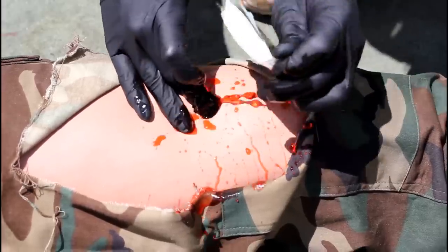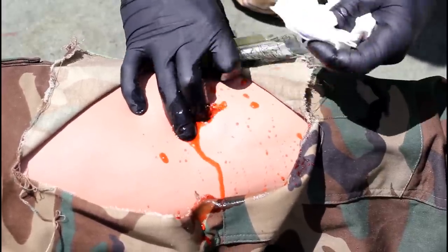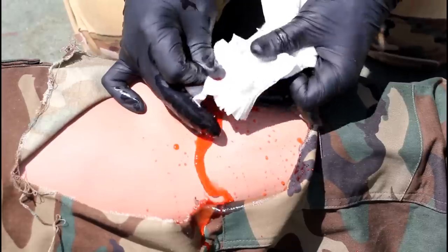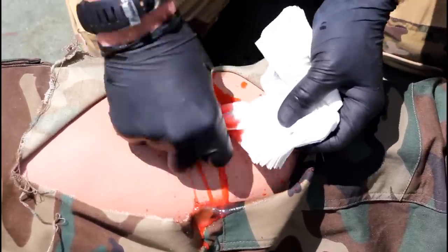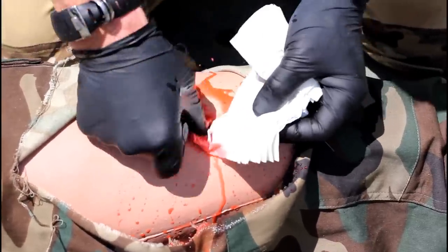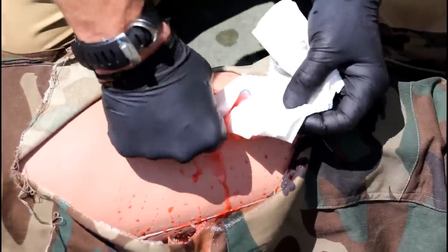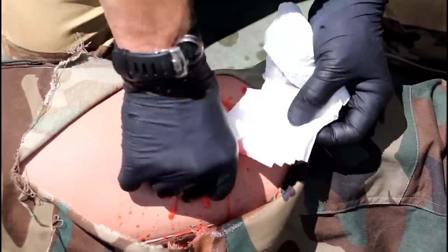As discussed in the directions for use videos, the key to successful use of combat gauze is to pack the gauze into the wound deeply so that it comes into contact with the source of bleeding. You must also pack enough gauze into the wound to completely fill any open space. A large wound might require you to use more than one combat gauze.